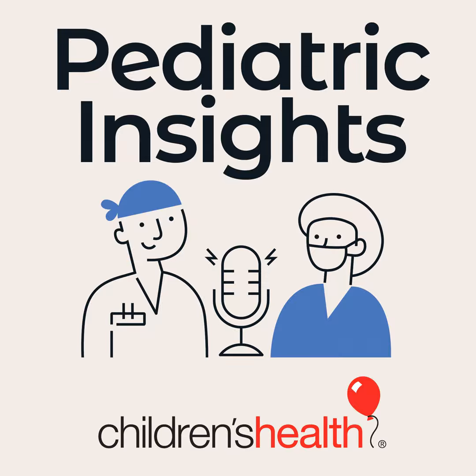So you're extremely versed in robotic surgery. Then what types of robotic surgeries do you offer to urology patients, and how do these procedures set Children's Health apart? At this point, and this has evolved, we started this in 2002, so 18 years, robotic surgery for pediatric urology really focuses heavily on kidney surgeries, typically patterns of obstruction or malformation that affect how the kidney can function and drain. We also can do procedures on the bladder, and this has to do with either structural abnormalities or functional abnormalities that can create problems with kidney function, drainage, or urinary tract infections. We also can do a variety of reconstructive procedures in the pelvis, which can be very difficult to reach with conventional open surgery as well.